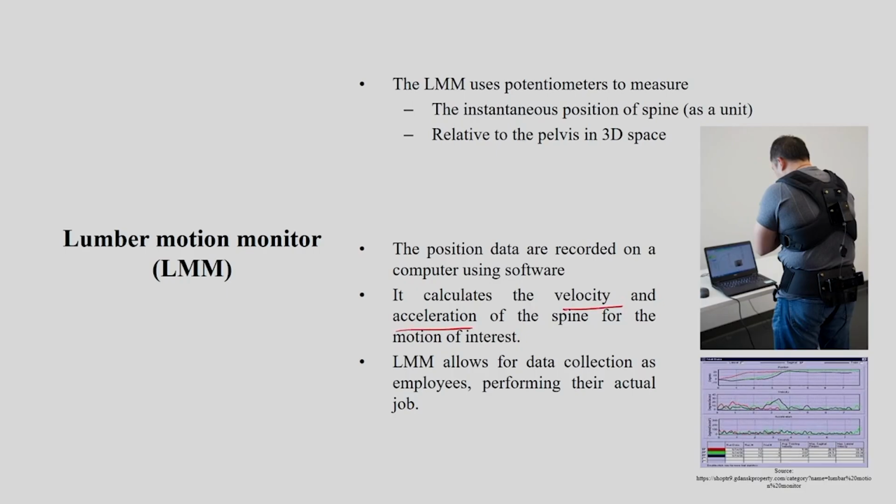LMM also allows for data collection while employees are performing their actual job. So this is very important: on-field data collection, in actual work settings. So real-time data collection is possible with LMM.